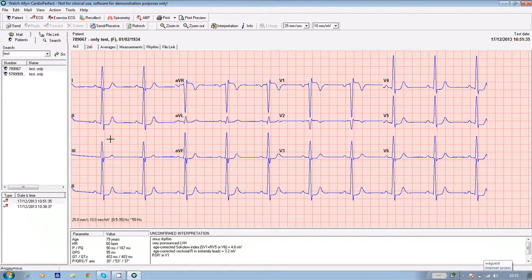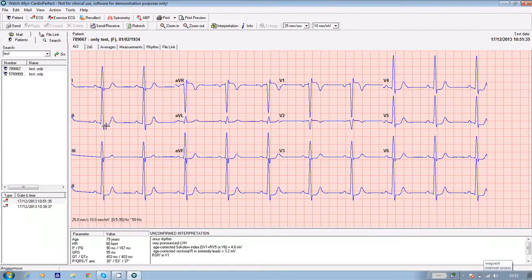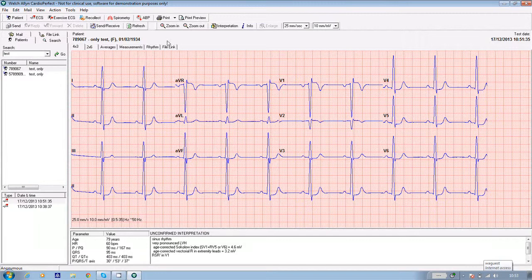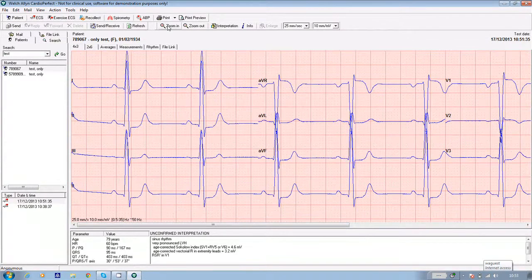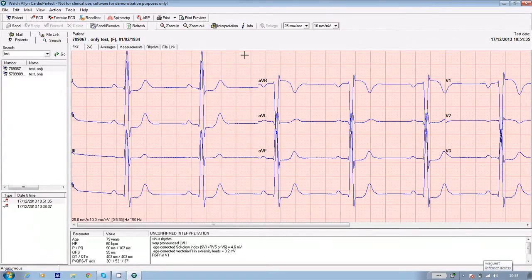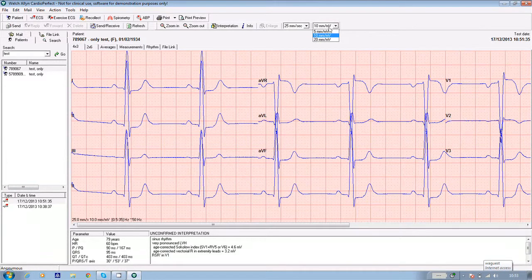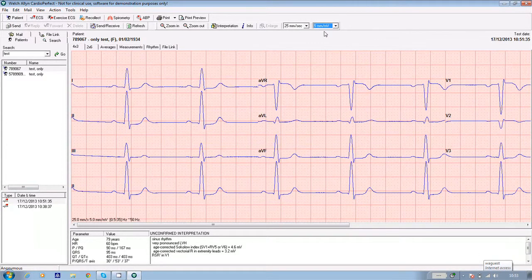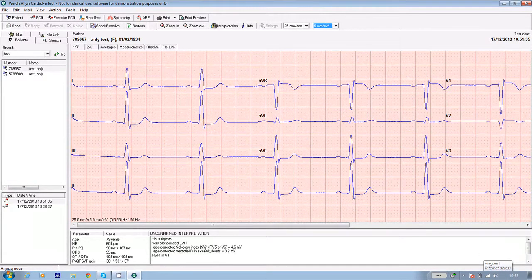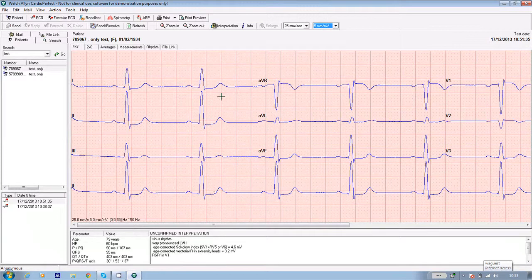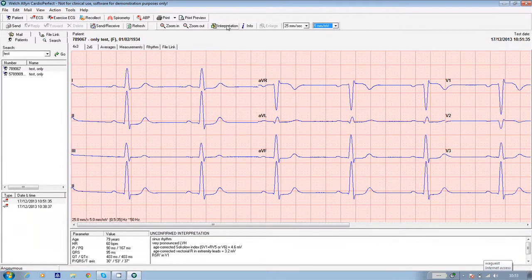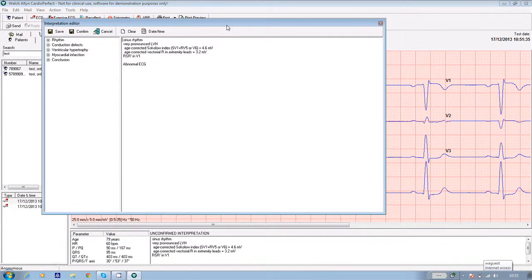If you'd like to look at the ECG in more detail, you can zoom into the test. You can alter the height of the waveforms or edit the interpretation by clicking on the interpretation icon at the top of the screen. So that's the resting ECG.